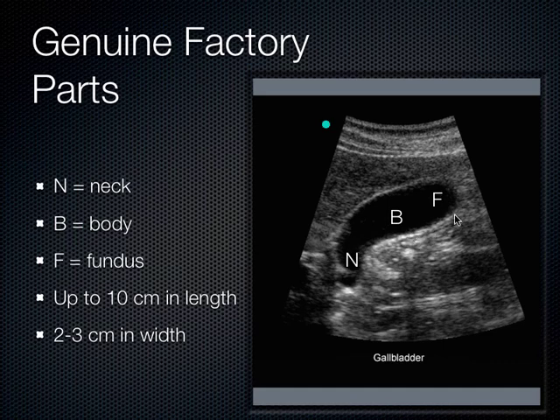Now, posterior to the gallbladder is what organ again? The duodenum. Specifically, we see here that usually it's the second portion of the duodenum, seen just behind the posterior gallbladder wall. And what's this right here? It's inside the lumen of the duodenum. Air. So air looks like this. Air, as I mentioned, can sometimes cast a dark shadow or a bright shadow. It's variable. And so, doesn't this look almost like a stone with a shadow behind it?